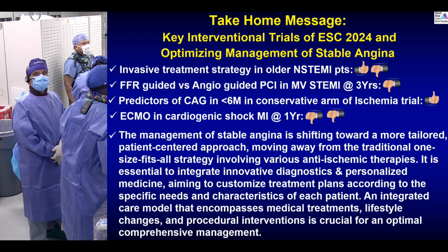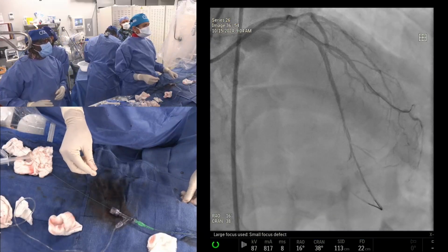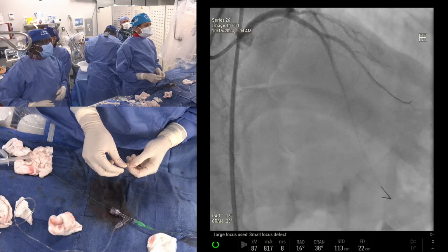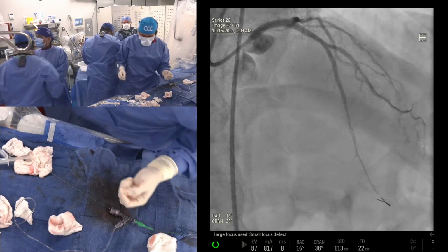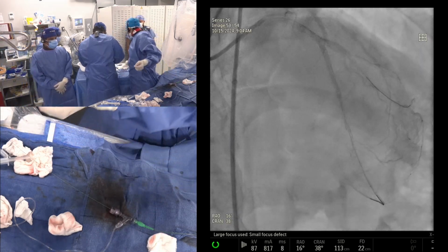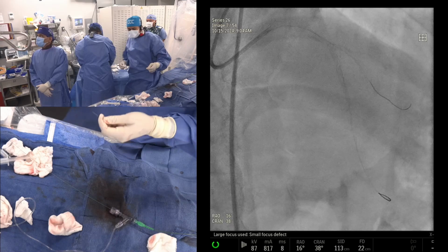There's a dissection in the distal. Because one of the, see there, can just do with the balloon. Yeah. Long balloon. The diagonal looks absolutely fantastic. So you want to go step by step of the crush. But let me put a balloon there. Yeah. Now let me get a new balloon for a long time.